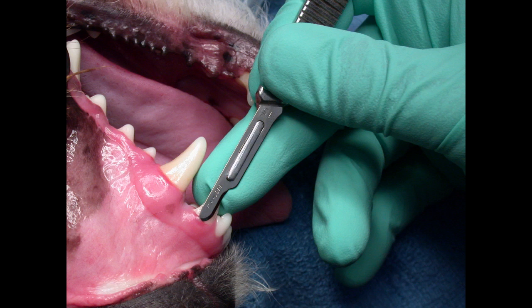One of the main things we need to keep in mind when extracting teeth is that any instrument we use — in this particular case a scalpel — we have our fingers not only at the edge of or close to the end of the instrument we're working with, but also positioned adjacent to tooth or tissue. I'm making an incision here, but I have my finger adjacent to this tooth, adjacent to the instrument, adjacent to the palatal mucosa and this incisor, and consequently I have total control over the scalpel.